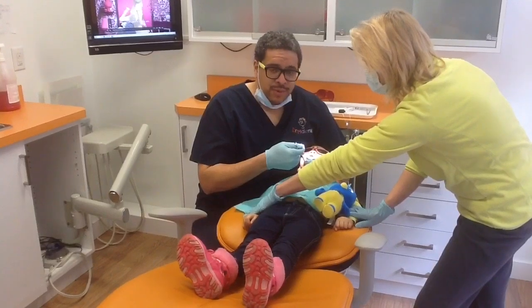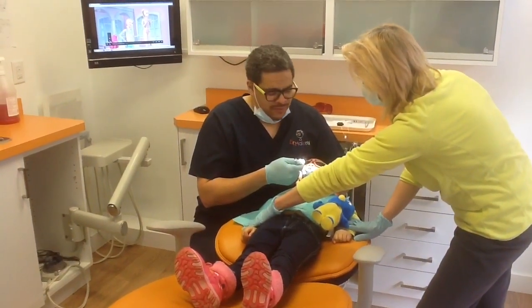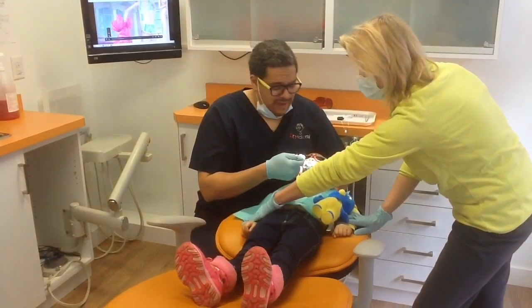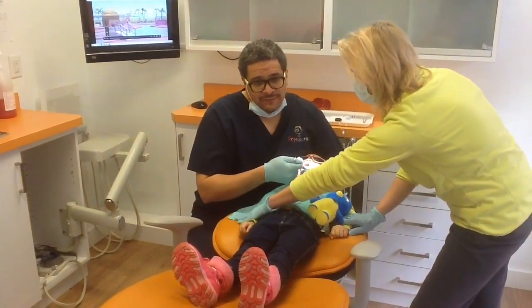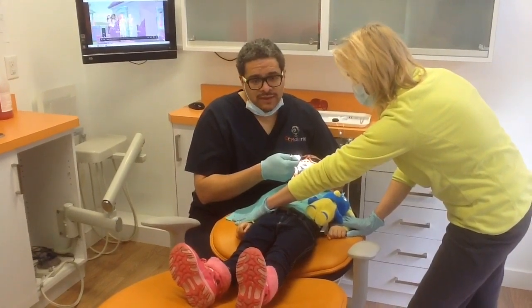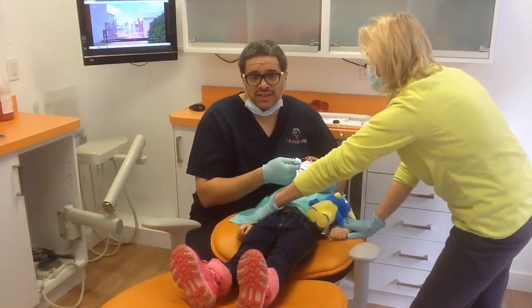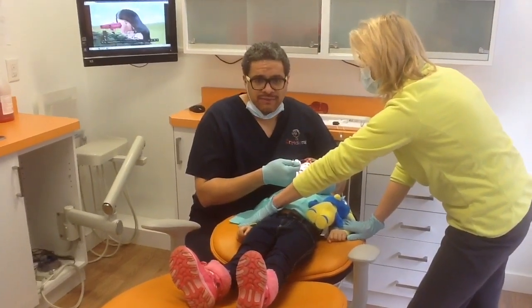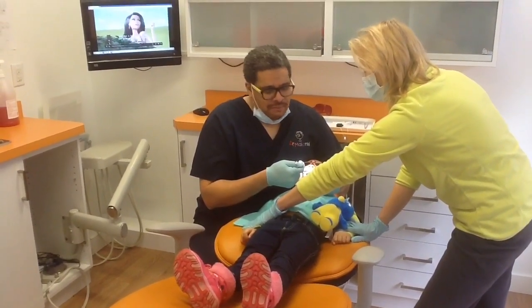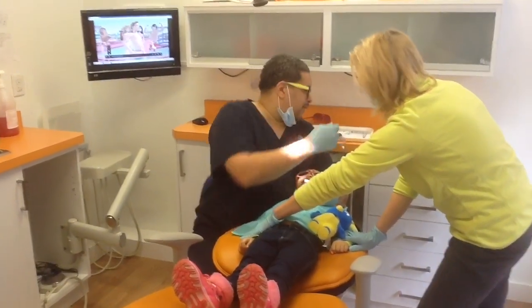When you inject, remember you want to inject very, very slowly. Sometimes doing injections is not what the patient wants, and it's tempting to go really fast — but you want to go very slowly. When you inject the solution too quickly, sometimes kids feel the pressure and react just from that pressure. Given slowly, they're already numb and they don't really feel anything going on for the most part, except what we call the yucky taste.